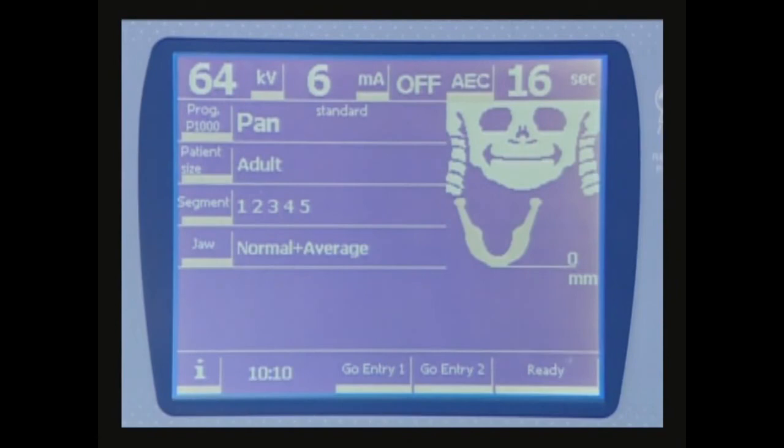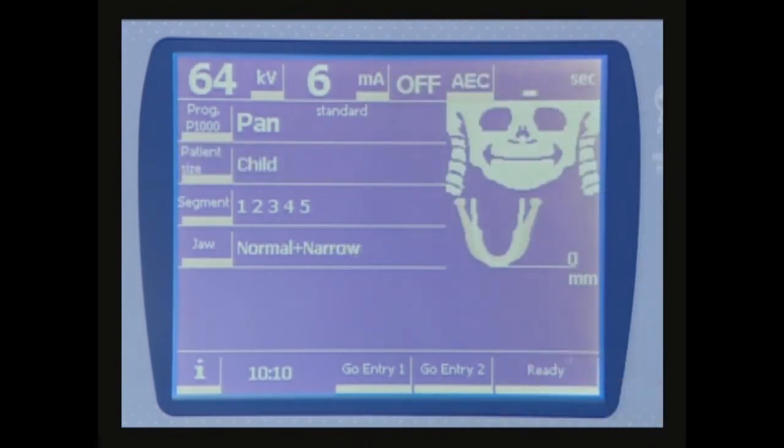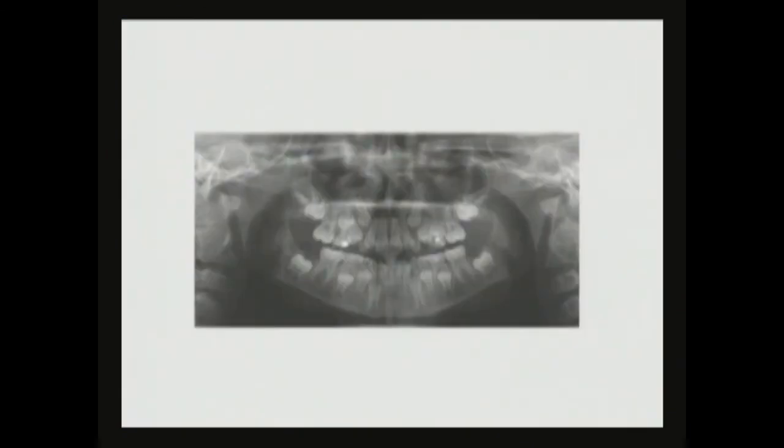If the patient is a child or a very small adult, select the child setting from the patient size field on the main display. With child setting selected, the width and height of the exposed area will be reduced and the jaw size automatically changed to narrow. Patient positioning is identical to the standard panoramic program.